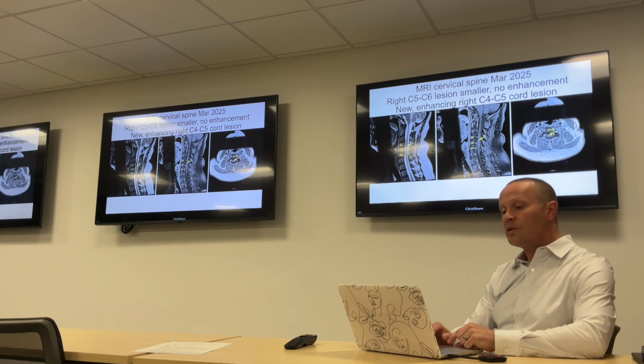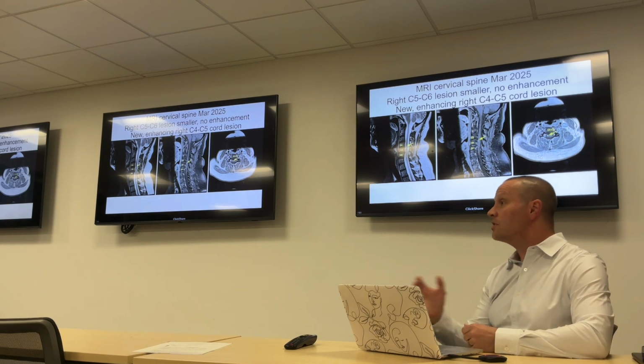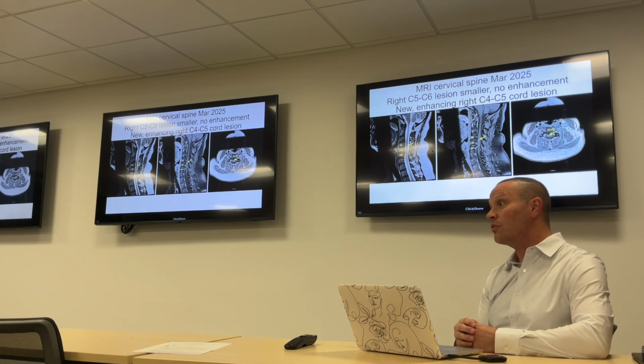They can also cause signal abnormality in the cord, which can be confusing because sometimes the signal abnormality caused by a disc herniation or by degenerative disease can be very similar to what an MS lesion looks like in the brain. That would not cause enhancement, though. Enhancement is only caused by something like a demyelinating lesion or a tumor, I suppose, but in this case, an MS plaque.